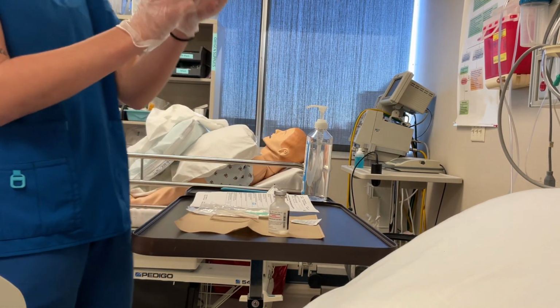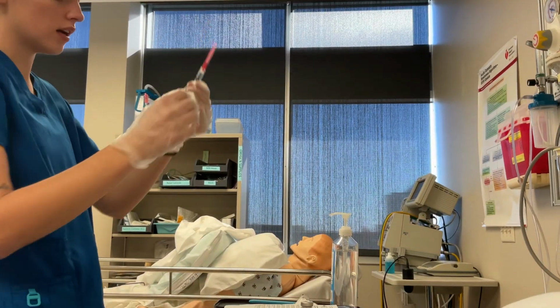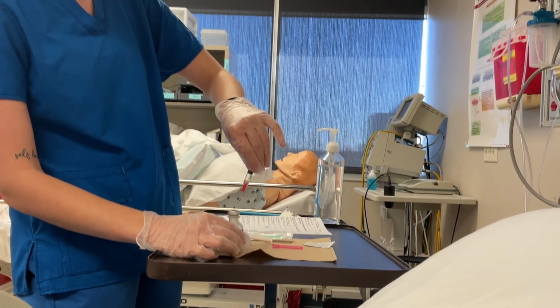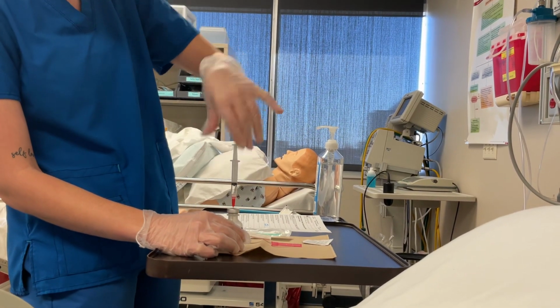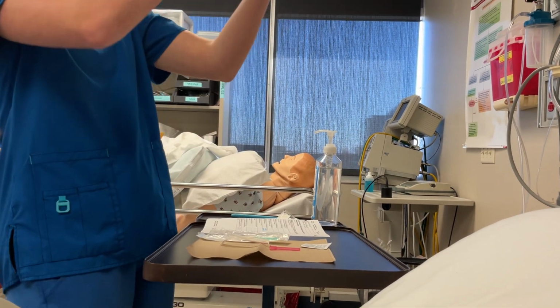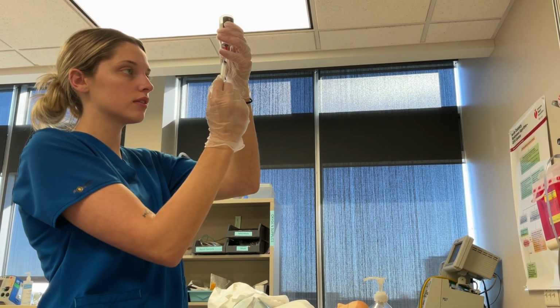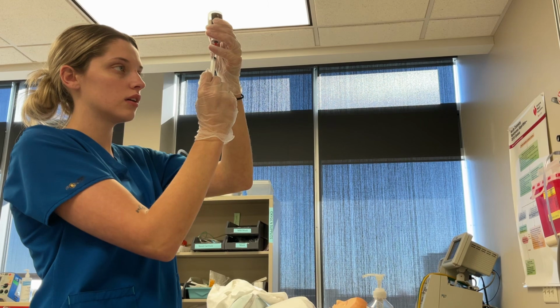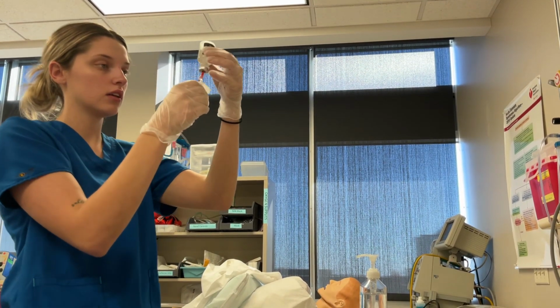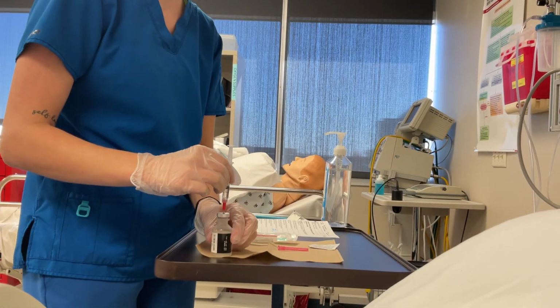I am going to draw back my medication for air, and then I will take this off, stick it inside the vial, push the air inside, and then I will draw back 1 milliliter with no air bubbles present. I would show my instructor to make sure I have the correct dose, and then I will take that off.